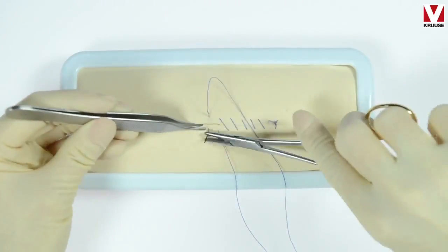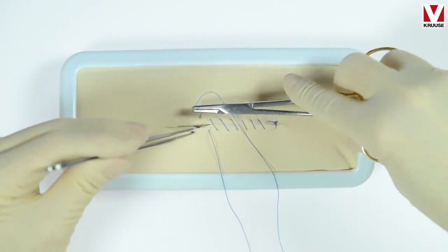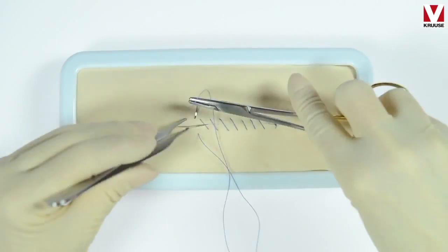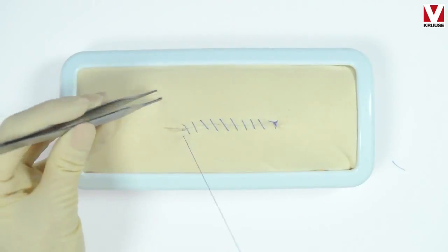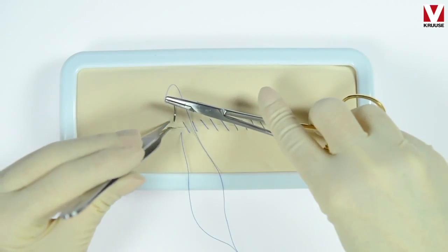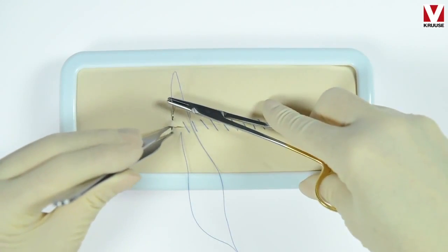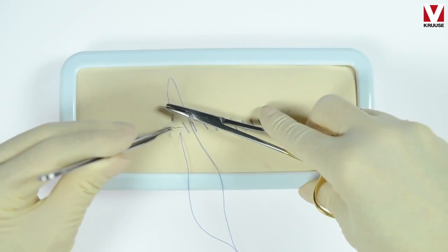So you see, you try to make the distance between the stitches equal. So we finish our suturing pattern now.